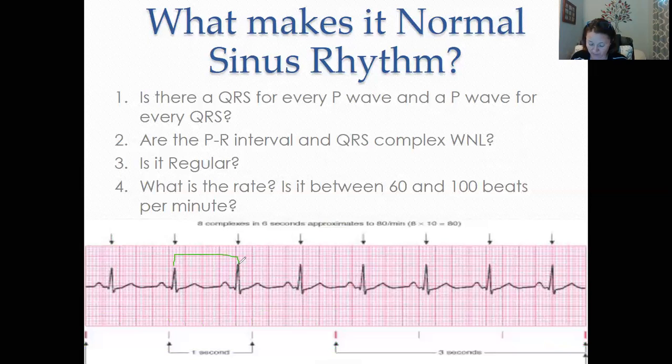I'm just getting my calculator out so I can do it along with you. Okay, easier said than done. Here we've got 1, 2, 3, almost 4. Almost like right here would have been 4. So almost 4 boxes. I'm going to go ahead and do 300 divided by 4 equals 75. That's pretty close to the 80 that we got. So large boxes divided into 300.